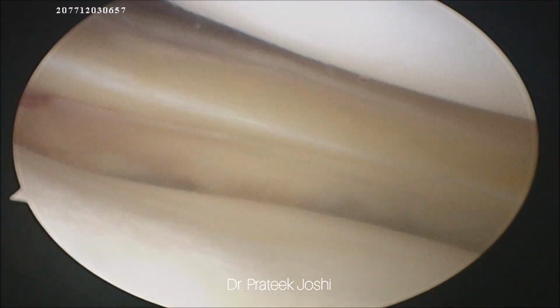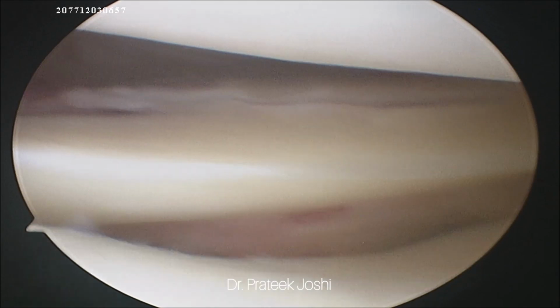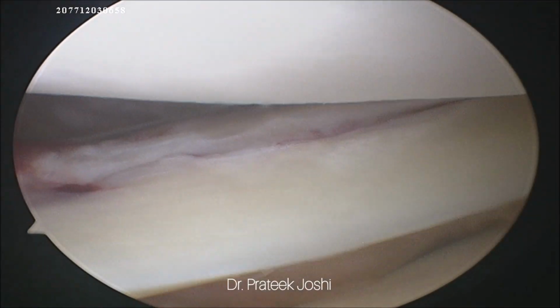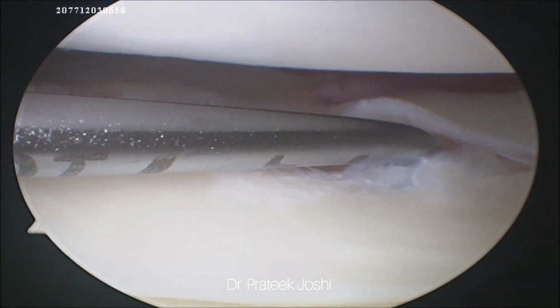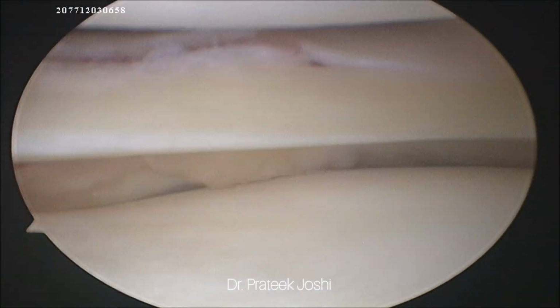And as we go in the lateral compartment, there is a tear involving the posterior horn of the lateral meniscus, which is around 2 centimeters in dimension, and it is in the red white zone. So we are going to repair this tear because in young individuals such tears should be repaired, and this kind of tears have good healing potential because they are in the vascular zone.